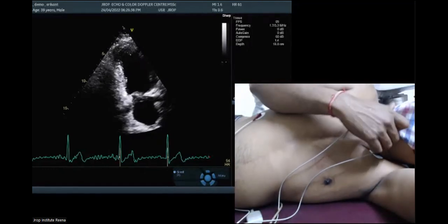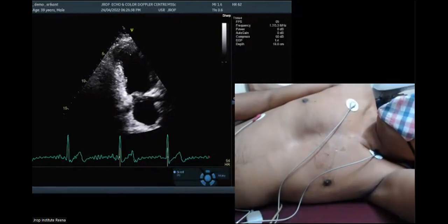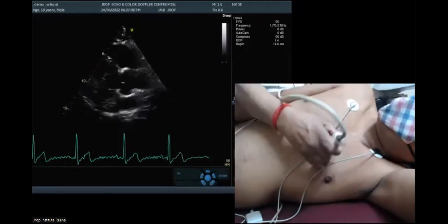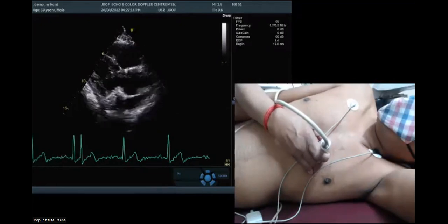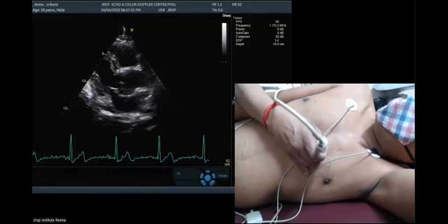Hello. Yeah, Ranjit. Show me again how to calculate stroke volume from VTI. Okay, good. Stroke volume from VTI. All right, give me a sec. What all do we need for a stroke volume? We need the LVOT diameter first of all. I'm going to utilize the measurement equation of the machine now.